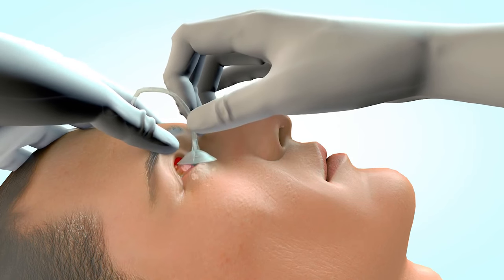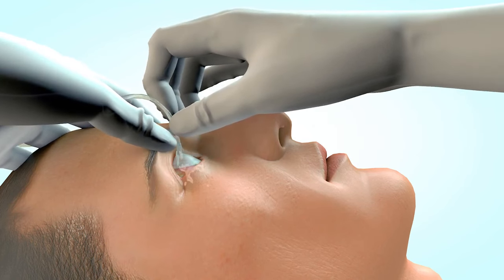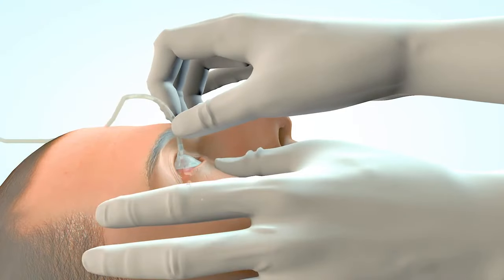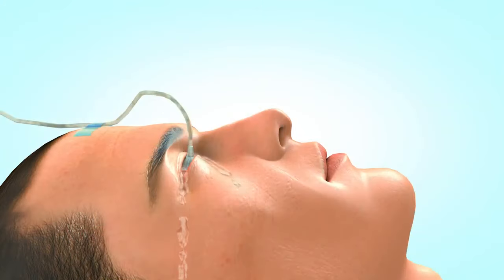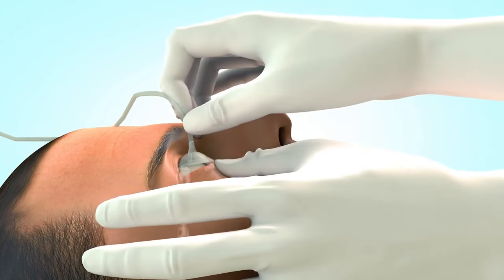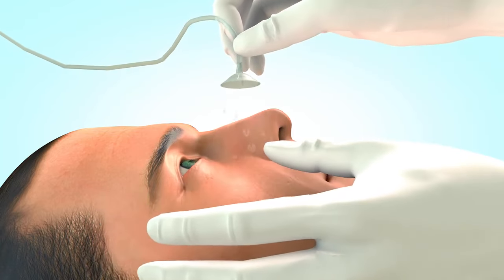To summarize: to insert, have the patient look down and insert the Morgan lens under the upper eyelid, then have the patient look up, retract the lower lid, and drop the lens in place. To remove, continue the flow of solution, have the patient look up, retract the lower lid, slide the Morgan lens out, then terminate the flow.